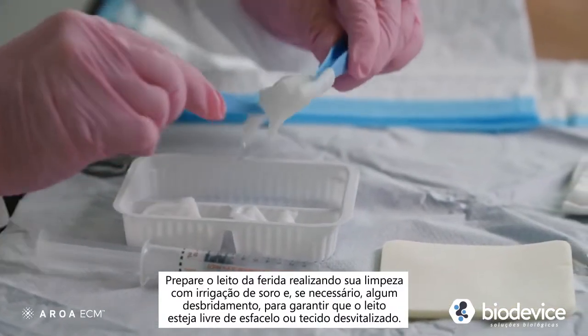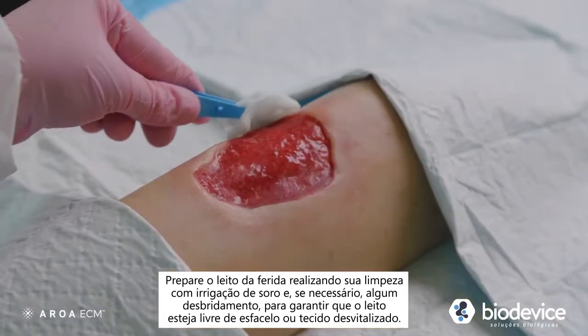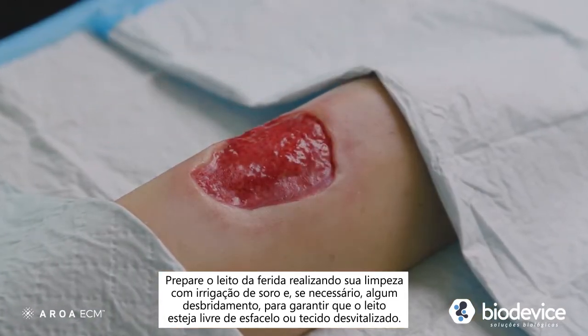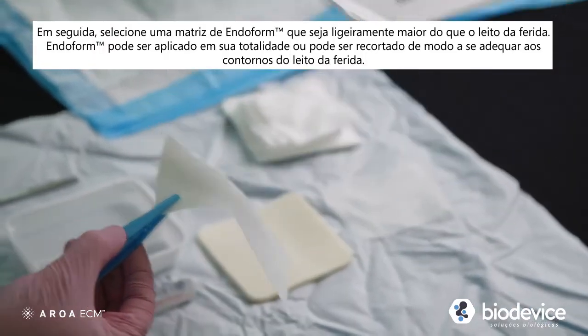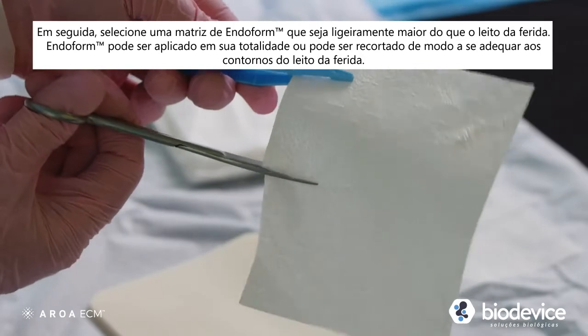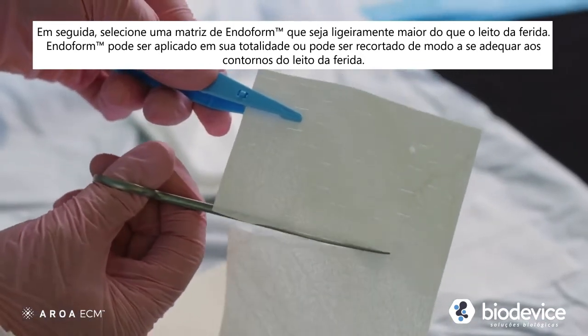Prepare the wound bed by cleansing, irrigating, and if necessary, debridement to ensure the wound is free of slough or devitalized tissue. Next, select a sheet of Endoform that is slightly larger than the wound. Endoform can be applied as a whole sheet or trimmed so that it contacts the wound edges.